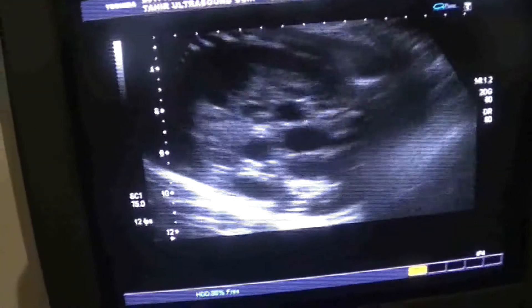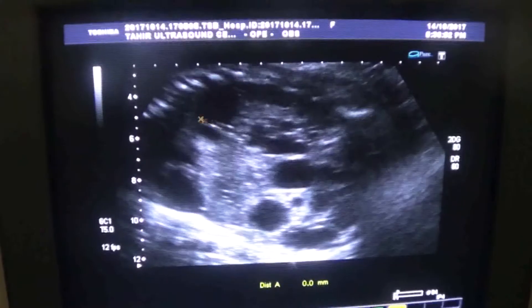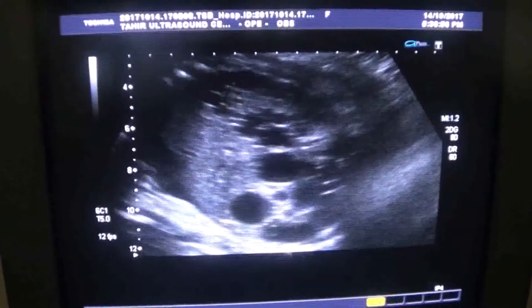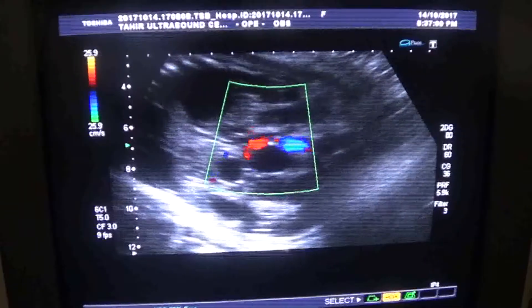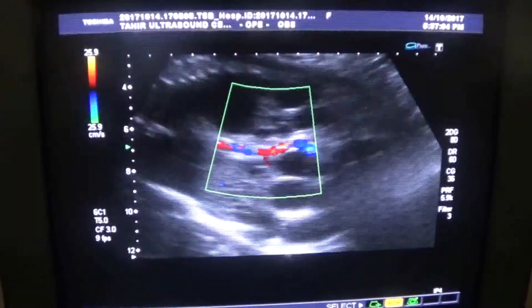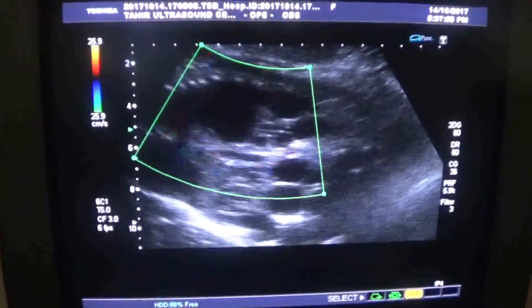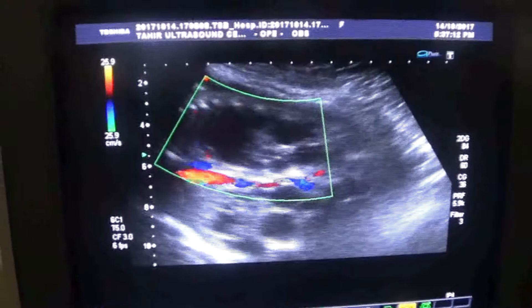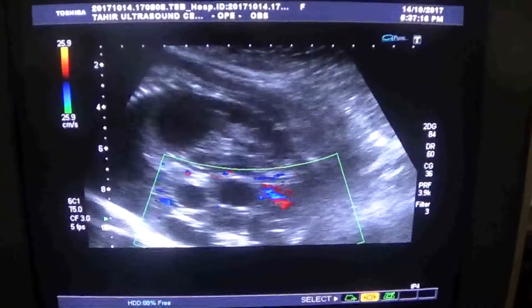This is the right kidney and this is the left kidney. You can see the aorta. The kidneys are not being perfused — no perfusion seen in either the right or the left kidney.